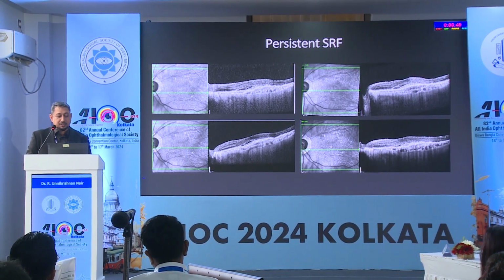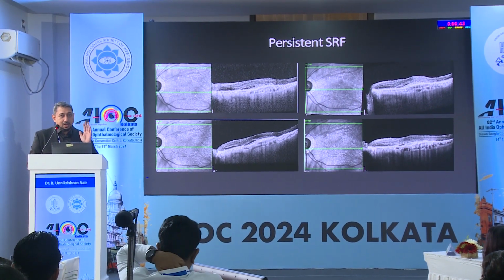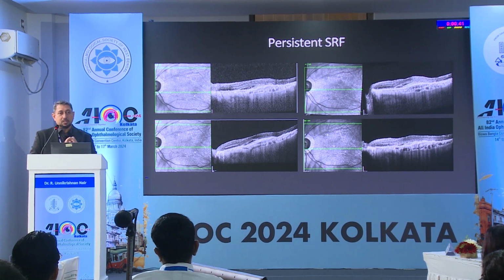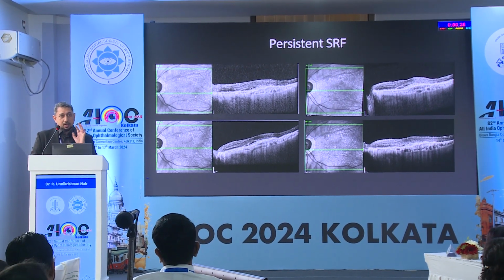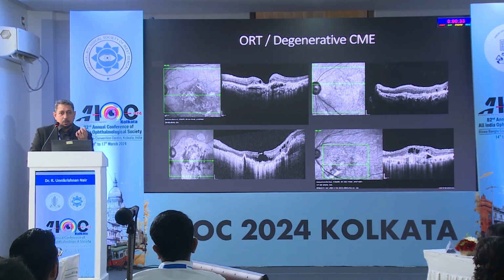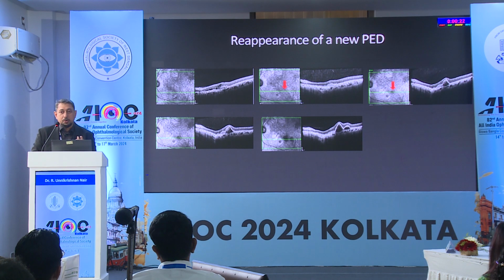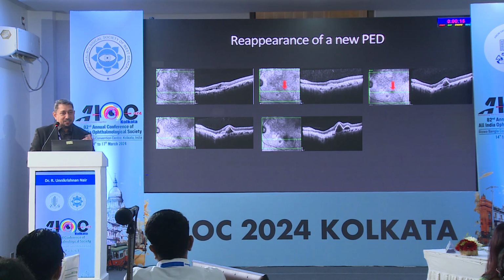So this is an example of persistent fluid. You have the fluid, there's no change in the sub-RPE activity, the fluid is stable, you can afford to wait. Time is your biggest weapon, no? You can wait, you can watch, and we don't use that weapon sometimes. Or when you see degenerative edema, that is thin-walled cyst, you know that it is not because of activity, it is because the RPE barrier has been broken and you have transudative fluid. Now, any recurrence of a PED has to be considered as reactivation. It's a very, very simple point. You have a flat PED, but when the PED rises again, activity is coming again.